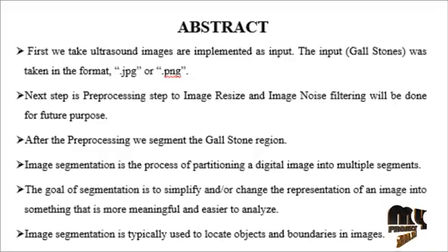Now I am going to discuss the abstract for this project. First, we take ultrasound images as the input. The input Gallstone images are in JPG or PNG format. The next step is pre-processing. Image resizing and image noise filtering will be done for future purposes.